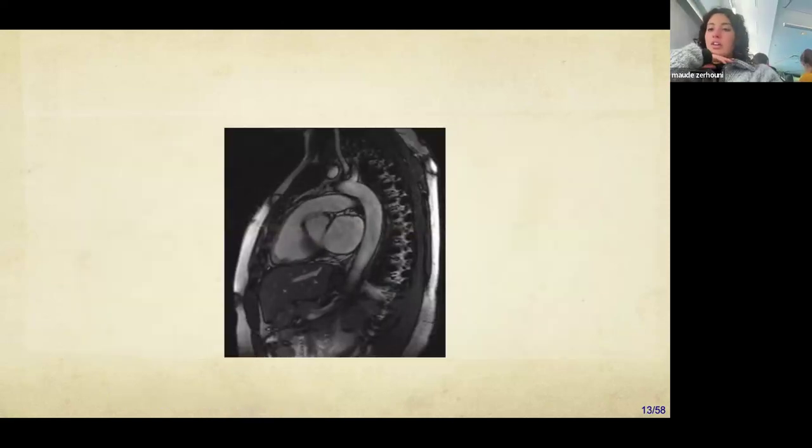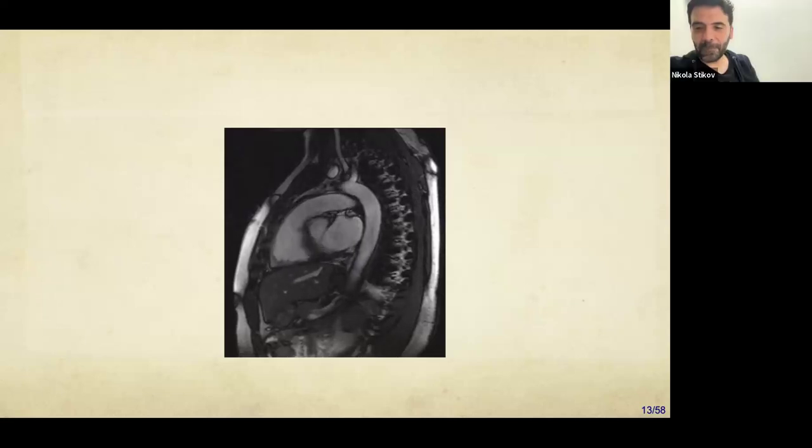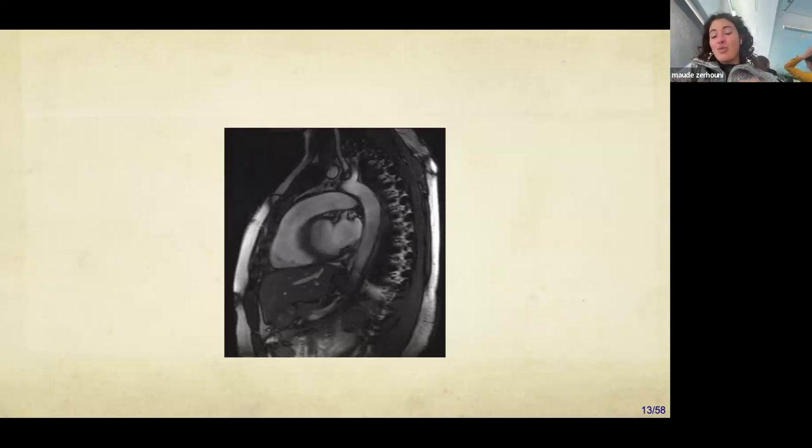But you then say that you're taking images with the movement and it's like 10 to 15 minutes. How can we manage it? Because a beating heart is not 10 to 15 minutes. So how do we reduce the time?